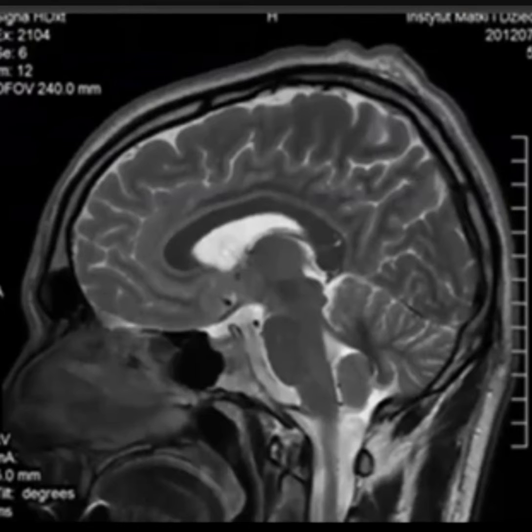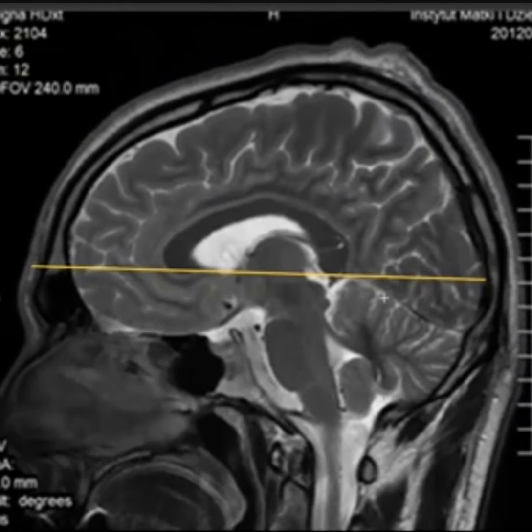So let's look at the angulation, positioning and anatomy of the scans. I'm going to describe the angulation and coverage for the axial brain sequence first. When I'm doing the axial, I'm dividing the brain into superior and inferior portions. So when we're doing an axial brain scan, we want to angle parallel between the genu and the splenium portions of the corpus callosum. The genu is the anterior portion and the splenium is the posterior portion of the corpus callosum.